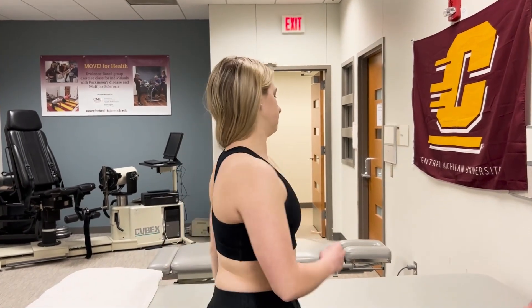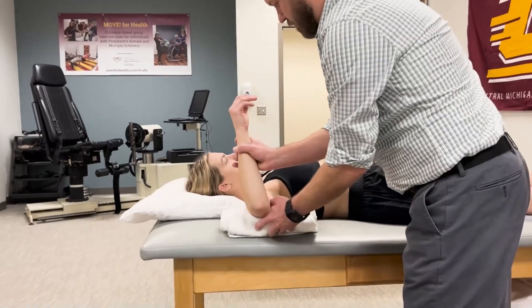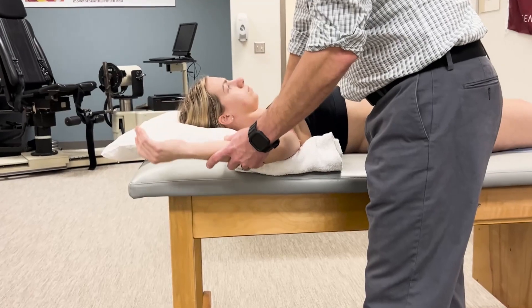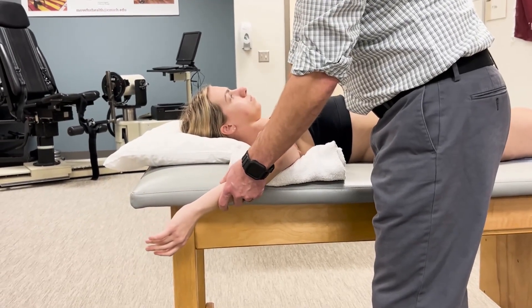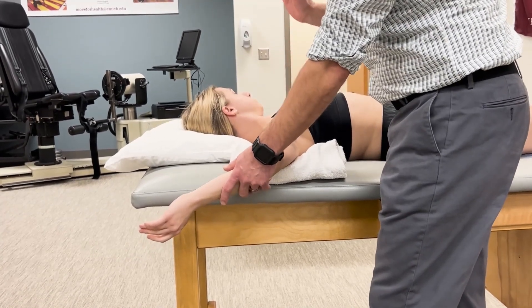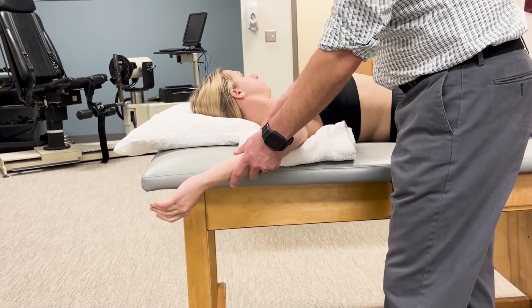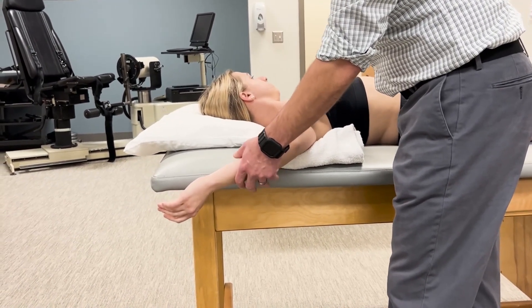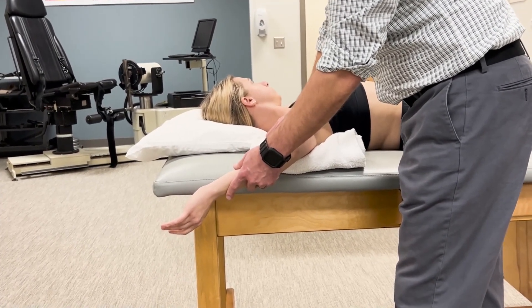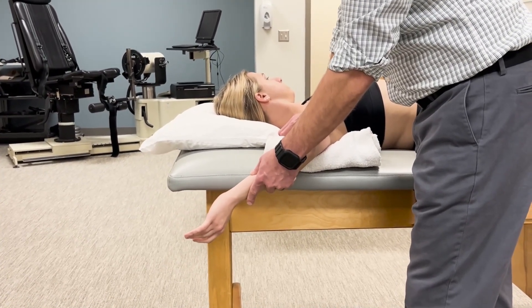Have the athlete lay supine so we can measure passively as well. We'll put this towel roll and bring the shoulder up to 90 degrees. Scapular substitutions are always a concern for glenohumeral range of motion measurements — not as much for external rotation, but one common substitution is posterior tilting of the scapula. The nice thing about the supine position is the table helps to limit or block that substitution. I can still place my hand on the anterior part of the humeral head and scapula to make sure we're not getting any proximal substitution.